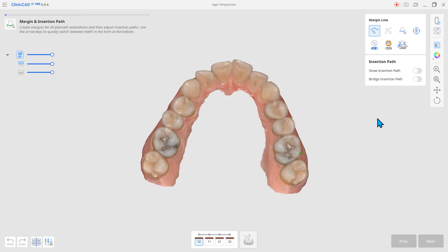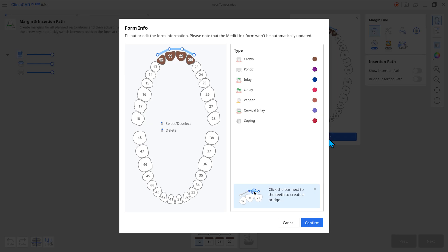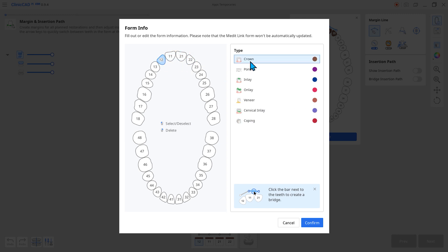Next, you can modify form information within Medit Clinic CAD after opening the program. You can edit form information registered in Medit Link, and you'll be prompted to input form information when no products are registered in Medit Link.